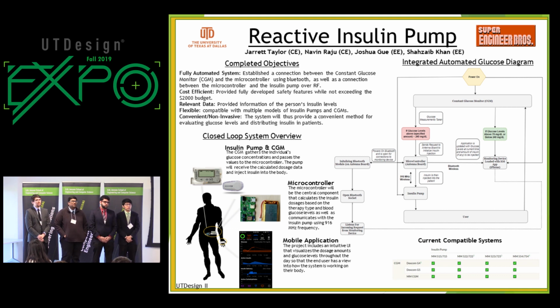So our closed loop system is approved by the FDA today? No, we're working outside of the FDA approval. Does this require a tube going from your pancreas to a port? Not your pancreas. It's just to your body. So a regular cannula just attaches to your body and is implemented just on top of your skin. What is that, just kind of needle looking? It's just a little needle, yeah.